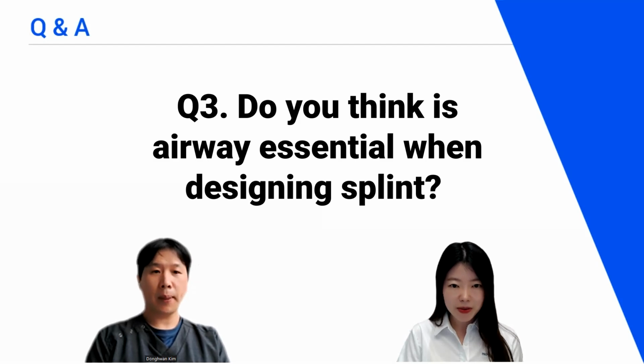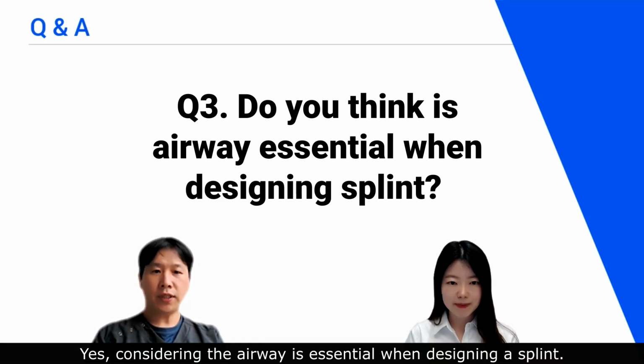Okay, so question number 3. Do you think airway is essential when designing splints? Yes, considering the airway is essential when designing a splint.